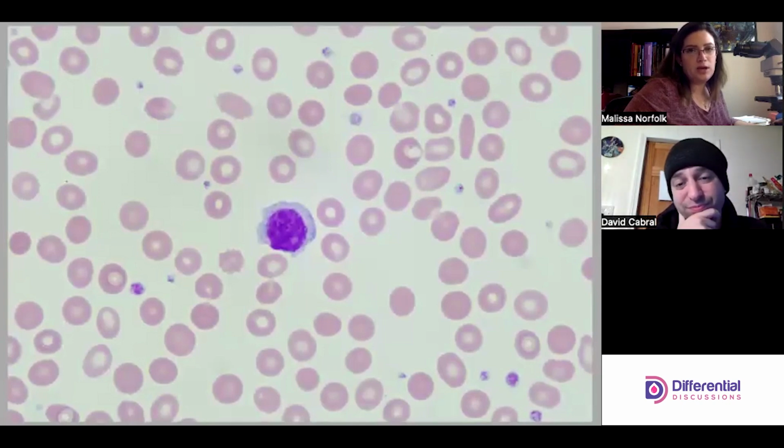Yeah, it could be. I think newer laboratorians and students might look at it and think it just looks more smudgy. But sometimes hairy cells look smudgy. It'll vary by patient. So again, this is another one where you take note of it and keep chugging along and see what else you find. Keep gathering evidence.